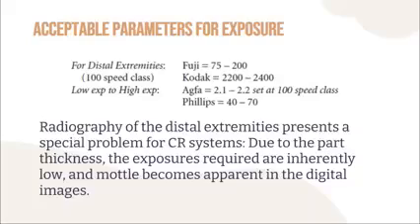In order for sufficient signal to be produced, the kVp needs to be higher, because if it is not high, mottle becomes apparent in the digital images. Additionally, the higher the speed, you can remember from film screen, the more sensitive they are to radiation. That means a lesser radiographic technique can be used, therefore lesser patient dose, but there is a sacrifice in the image quality. The same applies to the CR and DR parameters.